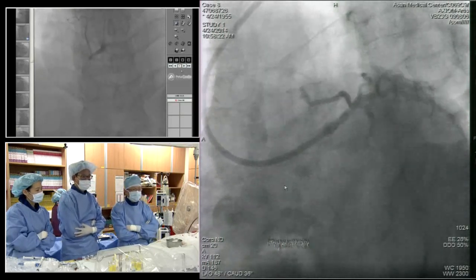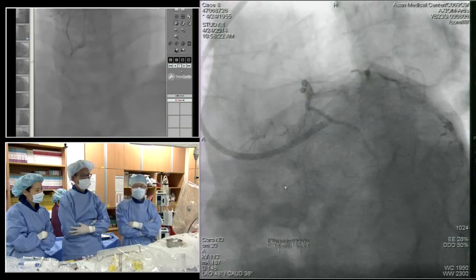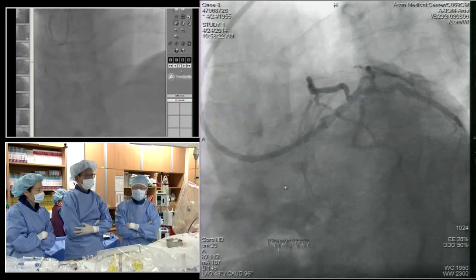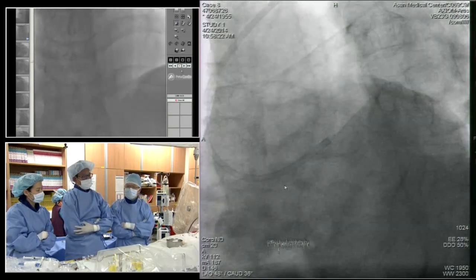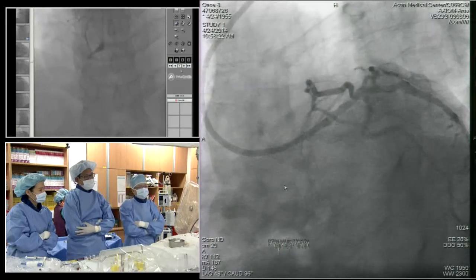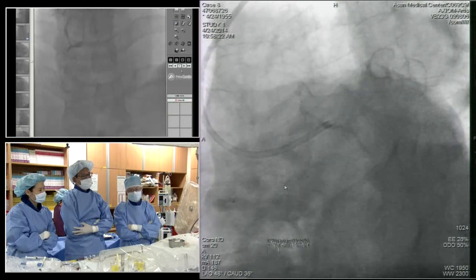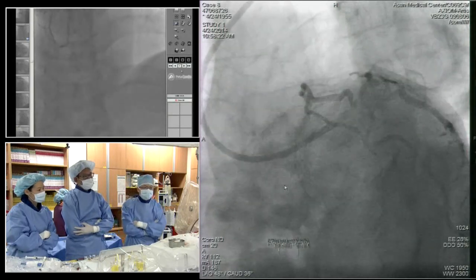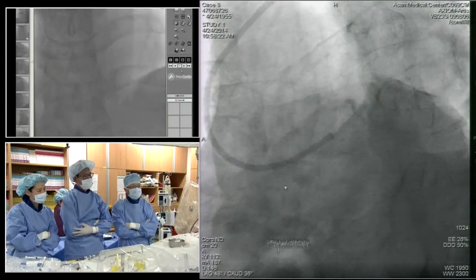Yeah. Distal left main, total occlusion of the right. So the question is, what therapy should we offer him? Obviously, the right coronary is a pretty significant CTO, takes some work, pretty good territory as well. And the LAD supplies collateral to the right as well, so that's why the FFR is pretty positive, even at rest.